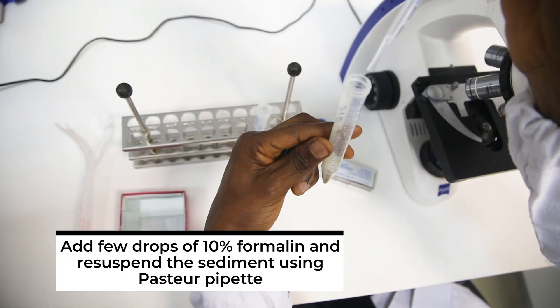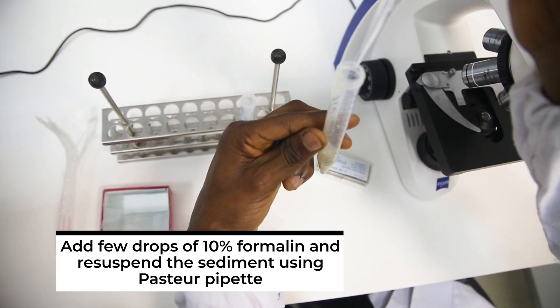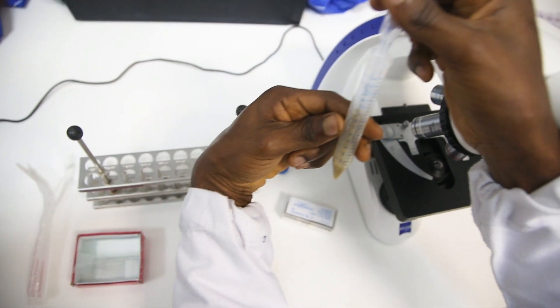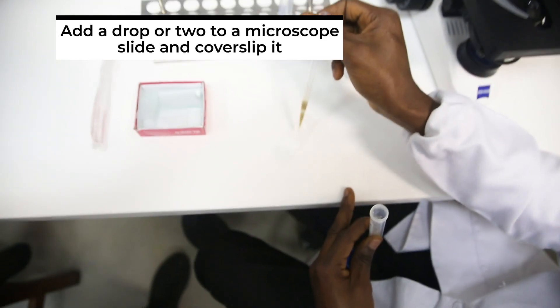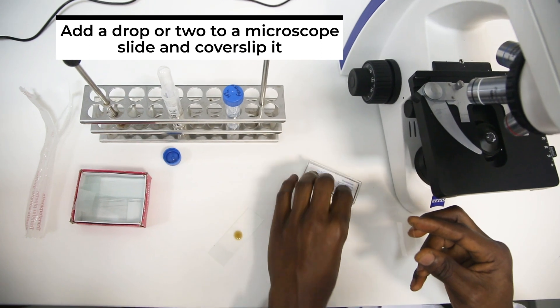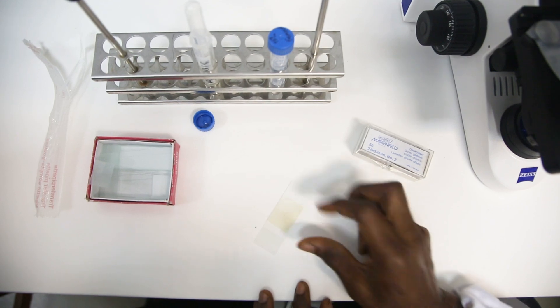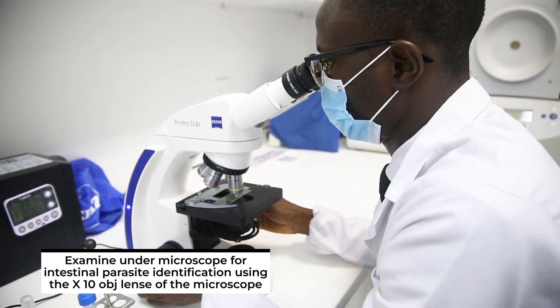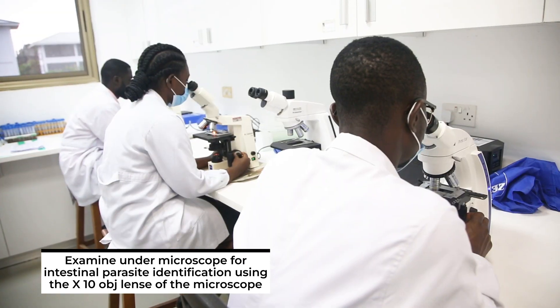After which, you examine under the microscope. You add a few drops of 10% formalin and re-suspend the sediment using a Pasteur pipette. Add a drop or two to a microscope slide, cover with a coverslip, and examine under the microscope for intestinal parasite identification using the x10 objective lens.